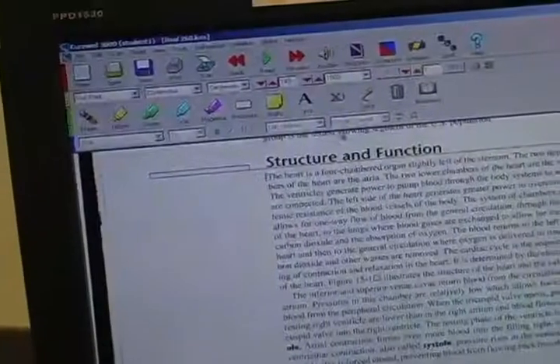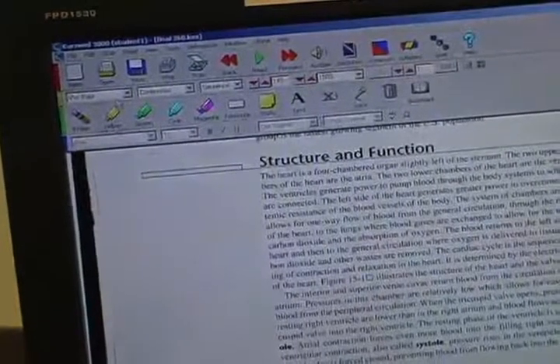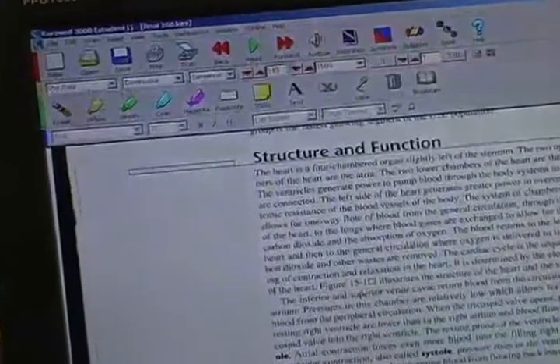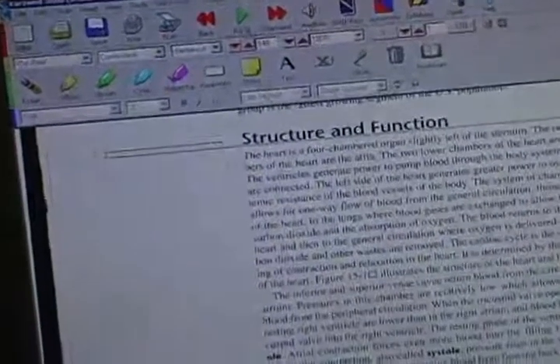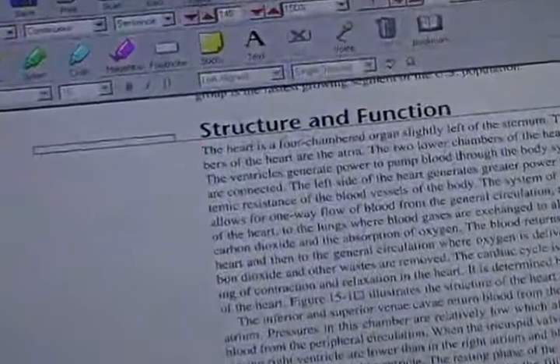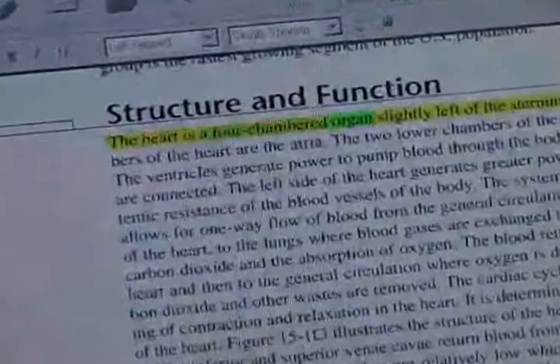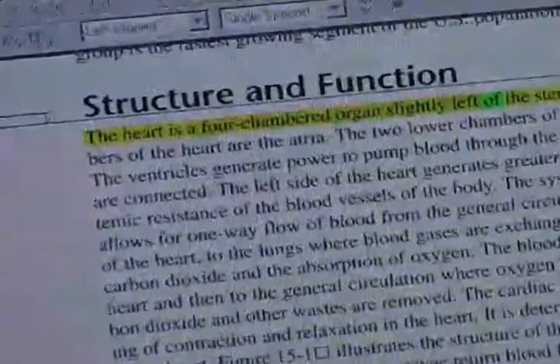Hi, my name is Brett. I'm going to show you how I use the Kurzweil text reader to read textbooks while I'm at college. I've got the Paul voice chosen and I'm going to start reading the anatomy textbook. The heart is a four-chambered organ slightly left of the sternum.